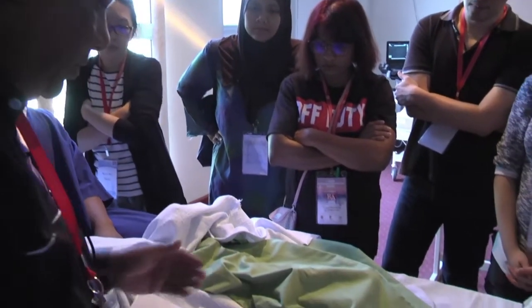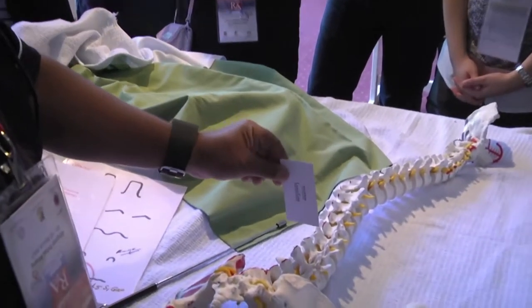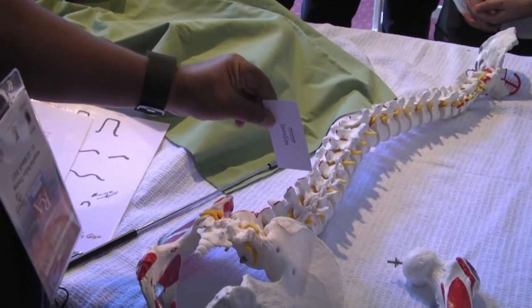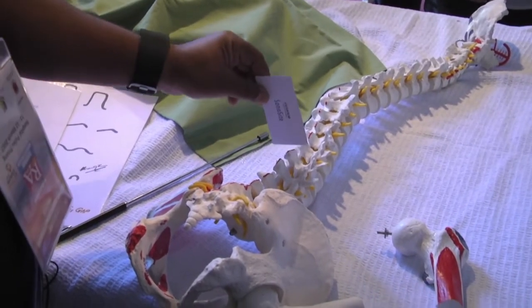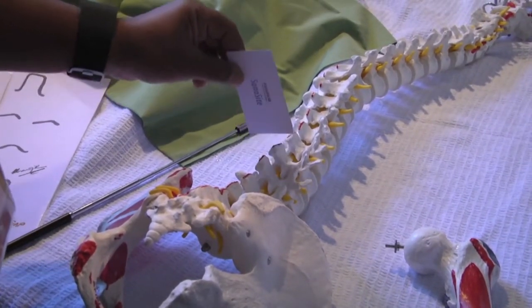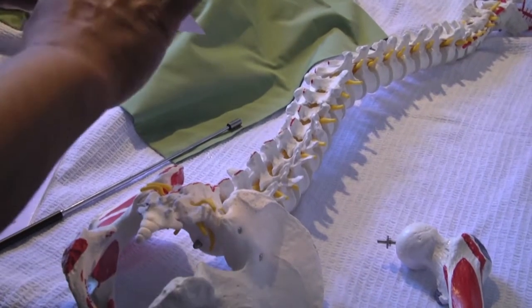Now when you do the imaging of the spine, you can imagine this is the ultrasound transducer. I could do a transverse scan, or I could do a sagittal scan. The transverse scan could be at the level of the spinous process or between the two spinous processes. So this would be a transverse spinous process view, and this would be a transverse interspinous view. The osseous elements that you will see during these scans would be totally different.